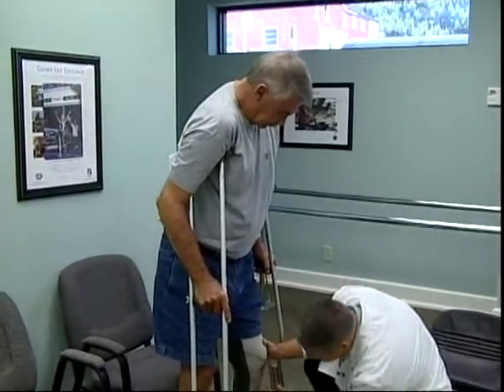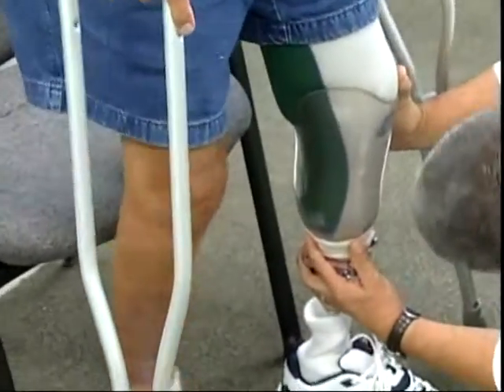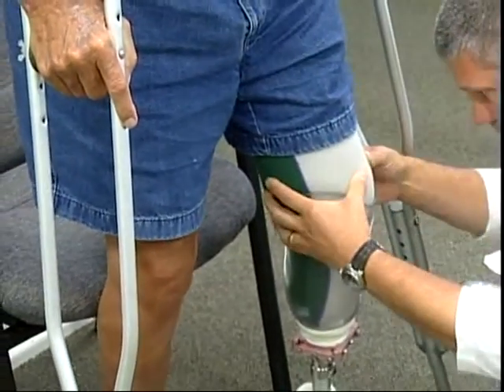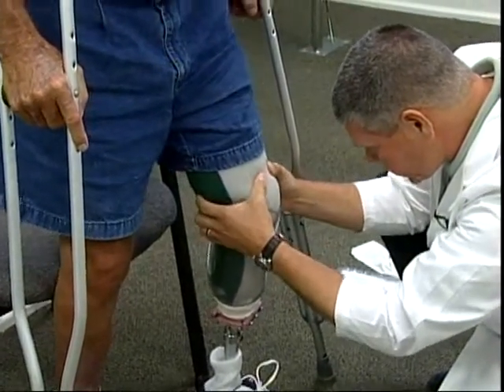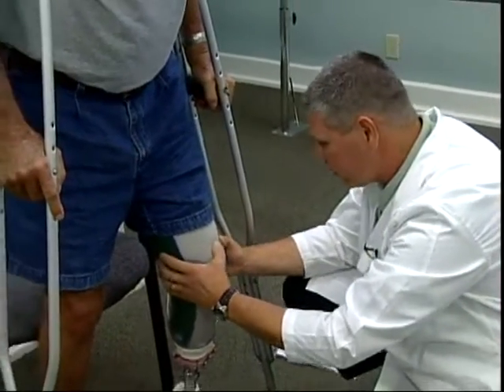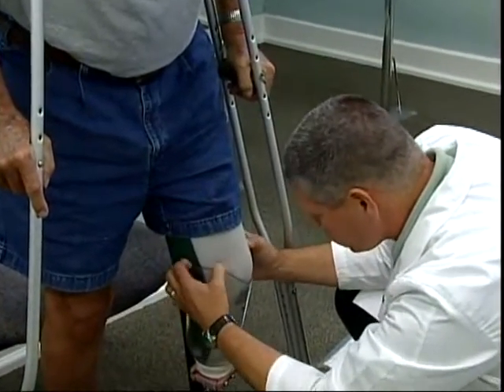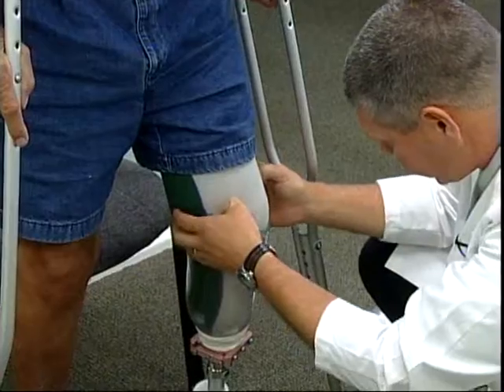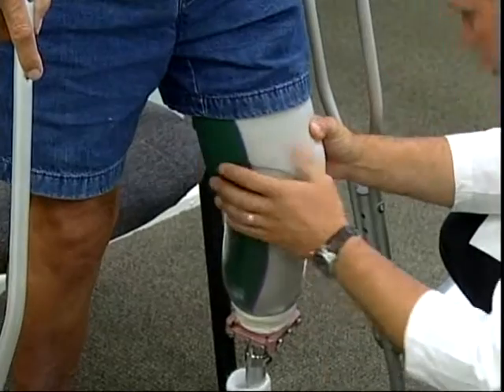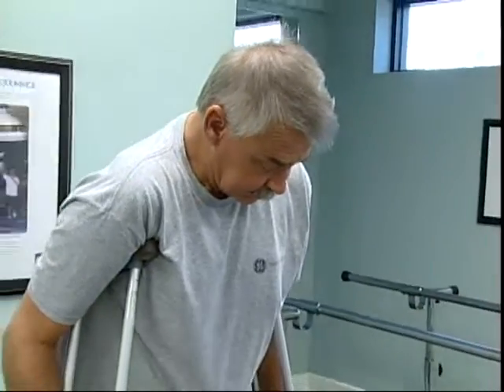The first thing I do is I look to make sure we have a total contact fit. We've got complete encapsulation of the residual limb inside the socket. We make sure there's no tightness anywhere. Make sure that the knee is fully engaged in the top of the socket. You wouldn't want that to interfere with his kneecap at all, right? That's correct. That would hurt. That's correct, yes, absolutely. Look at the trim lines. Make sure the condyles of his femur coming down are clear. Everything looks good. And then the last thing I do before we introduce the vacuum to the system is I ask the patient, how's it feel? Feels great. Okay.